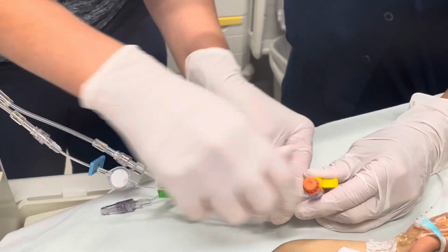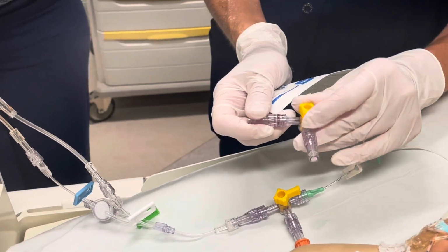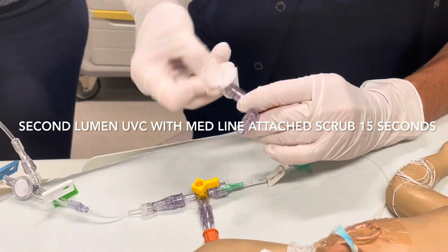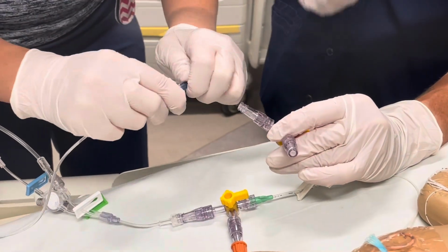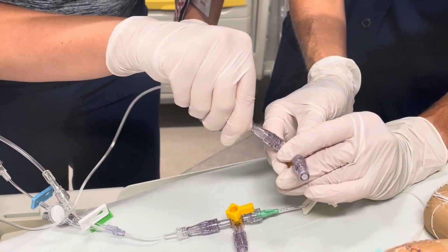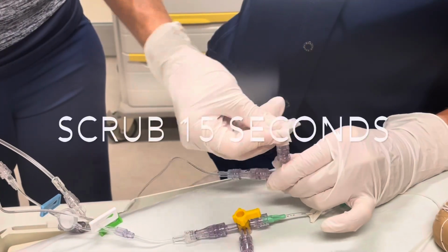This is a dual lumen UVC. The second lumen is going to be used for your medication line. Again, make sure the IV fluid has been turned off to the baby. You will be scrubbing your microclave before accessing it. The first nurse will attach your med line to your microclave. And we add another swab cap to the microclave on the other port of the stopcock.